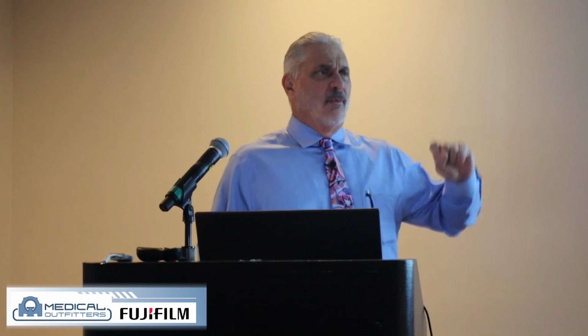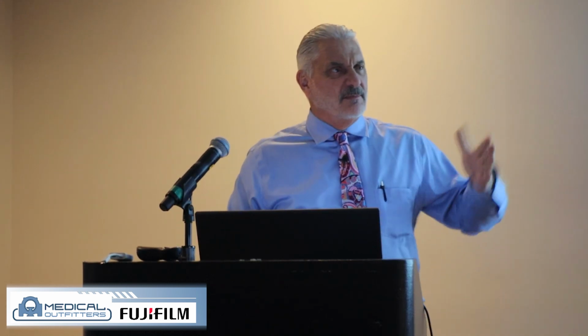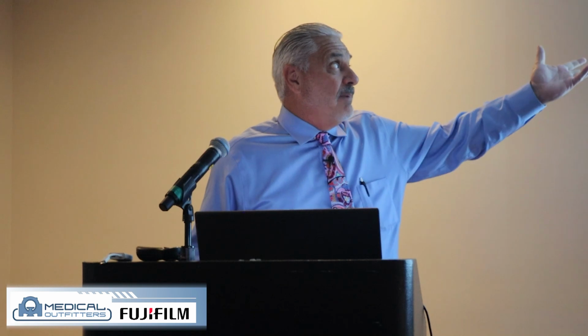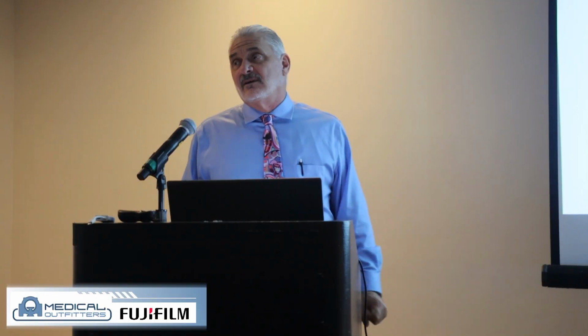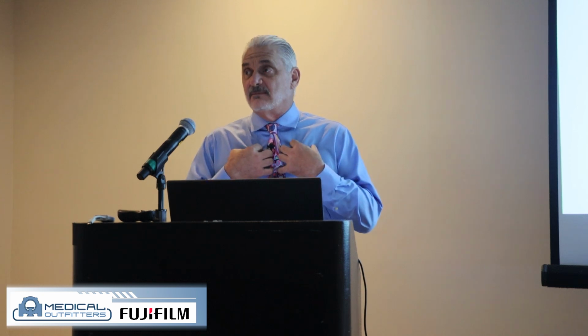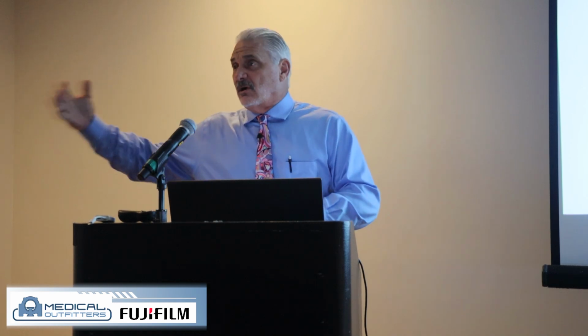As radiologists, you're well aware that they shouldn't have a calcium score if they've had any major intervention in their heart to begin with. It eliminates them from the first step and puts them into a follow-up step of either a catheterization or possibly even a CTA. I have patients ask me all the time, should I have a CTA done or should I go to my cardiologist and have a catheterization done? The gold standard is a catheterization, but it's much more invasive than a CTA. I would much rather have a CTA myself first to see if there is any reason to take myself up to that next step or maybe talk to the cardiologist.